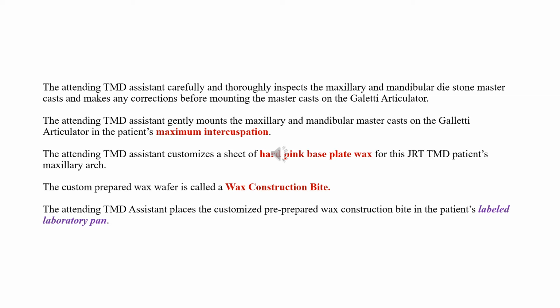The attending TMD assistant customizes a sheet of hard base plate wax for this JRT TMD patient's maxillary arch. Notice this is before. So if you haven't prepared the wax, you didn't do your job. If it's not pre-cut and prepared, you didn't do your job. And it's supposed to be before the patient's seated.